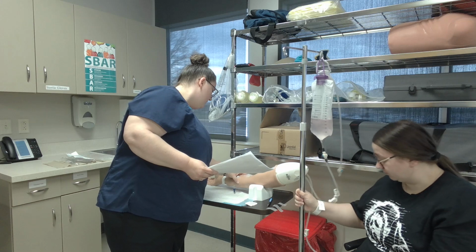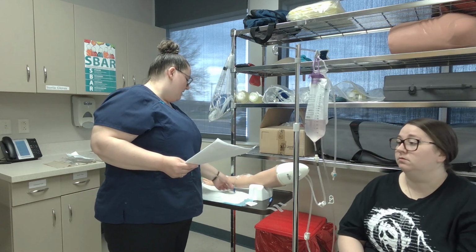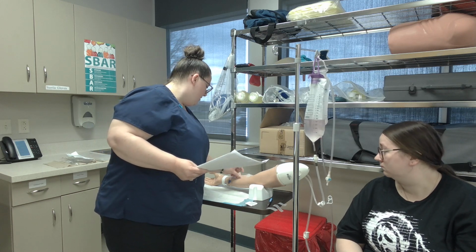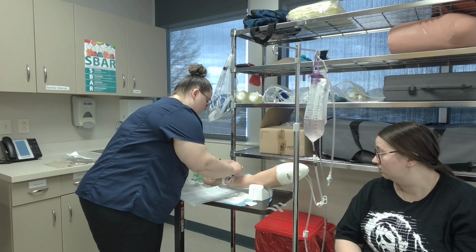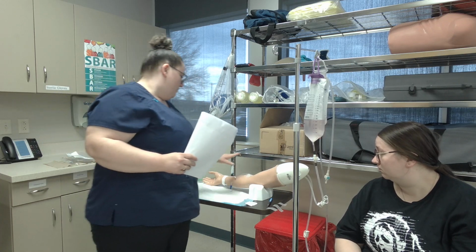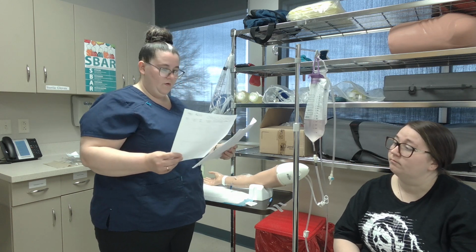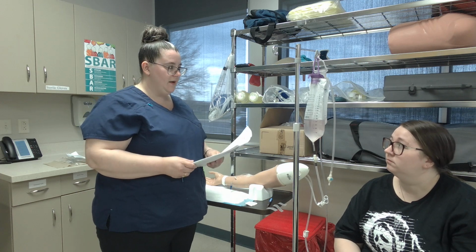Everything looks good. We're checking the date. It's 4/15. That is good. Per Southwest Tech hospital policy, we are changing every 96 hours. So we're good with that. Everything looks good. I am going to go back to my med cart and get everything ready, and then I'll be back. Okay? All right.